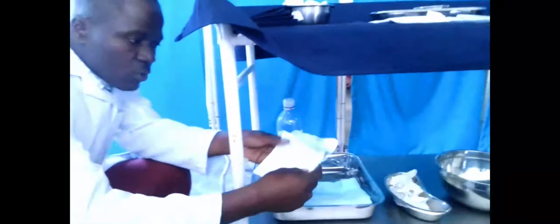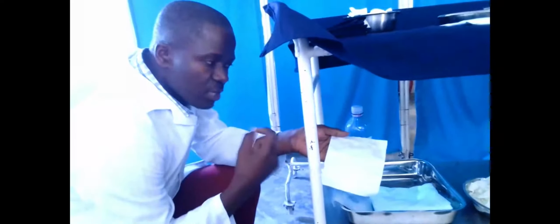Then we've got Vaseline gauze. The Vaseline gauze is also on the bottom shelf because it is not sterile. We're going to put the Vaseline gauze after you clean. We're going to see how we're going to put it. Then we've got an incontinence sheet. It will be put underneath the patient's buttocks or back so that you don't soil the linen as you clean. Then we've got a receiver. This receiver contains examination gloves. Examination gloves can be worn if you want to examine the area, because you don't want to touch the linen in case it's soiled.